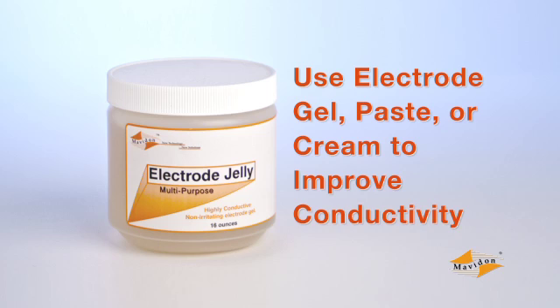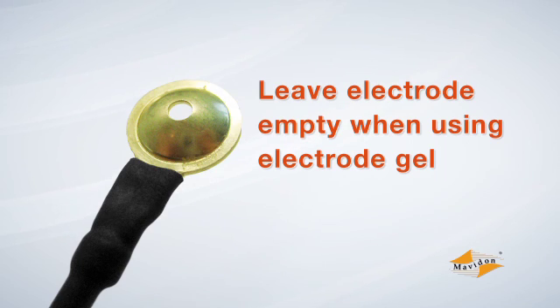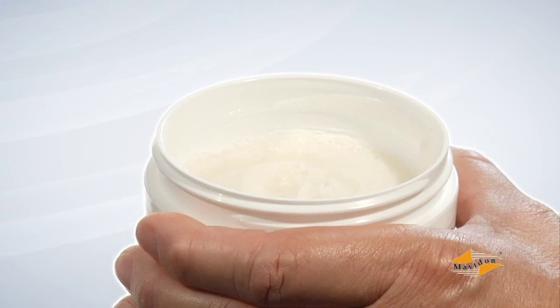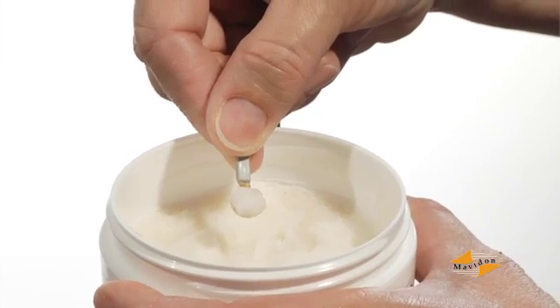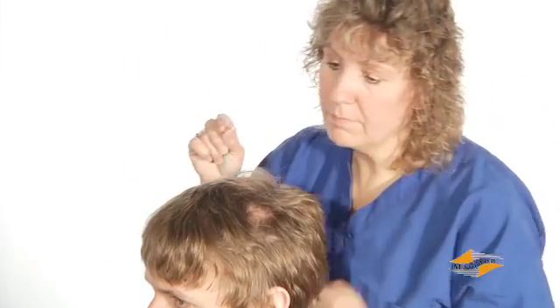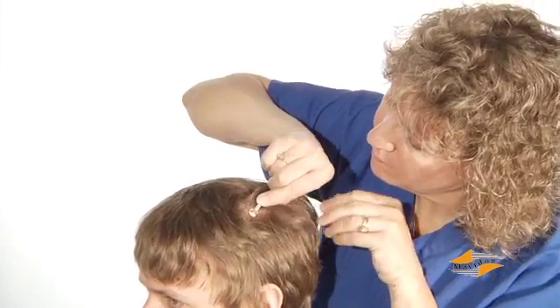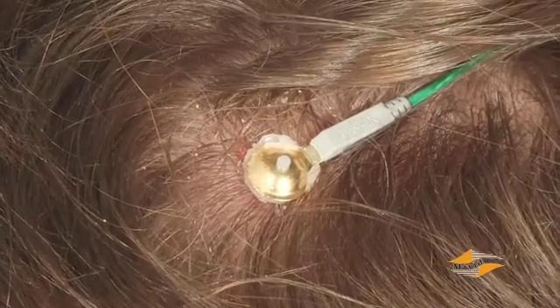Electrode gel is easily replaced throughout the recording without disturbing the electrode and is the better choice for long-term monitoring. The gel is added after the electrodes are in place, so leave them empty as you secure them. Electrode paste and cream do not dry out as quickly, so they are recommended for sleep or ambulatory tests where you will not have access to the electrodes during testing. The material must be in the electrode as it is applied, so dip the electrode into the paste or cream and scoop out enough to fill the cup. Place it on the patient's head and press firmly until some of the paste or cream appears through the hole or at the edges. The paste will keep the electrode in place until you secure it with collodion.